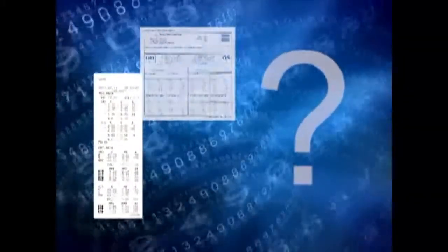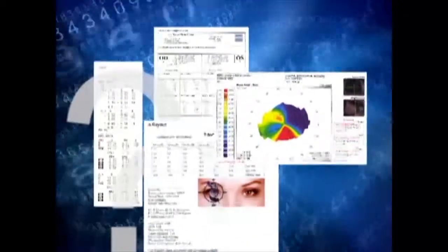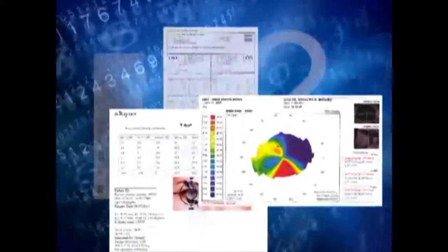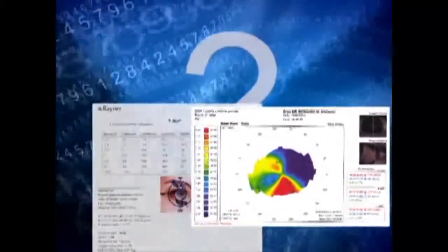and axis. Variance between manifest or wavefront refraction and keratometry or topography is widely prevalent, however, and the consequence is that the surgeon must rely on his clinical judgment to treat astigmatism and still have to pick a number, not to mention when keratoconus coexists with cataract.